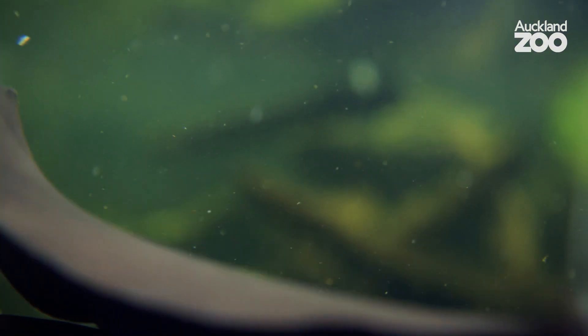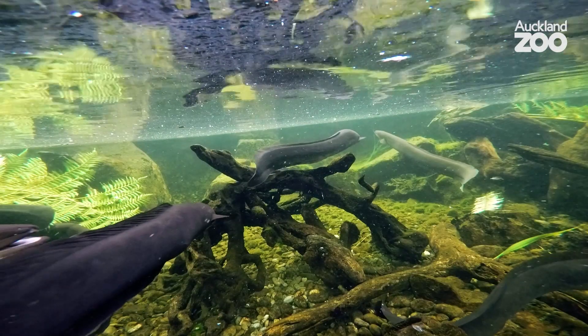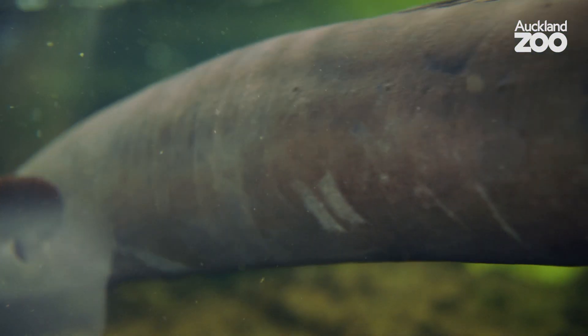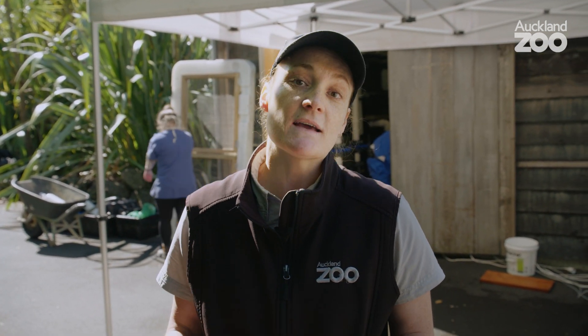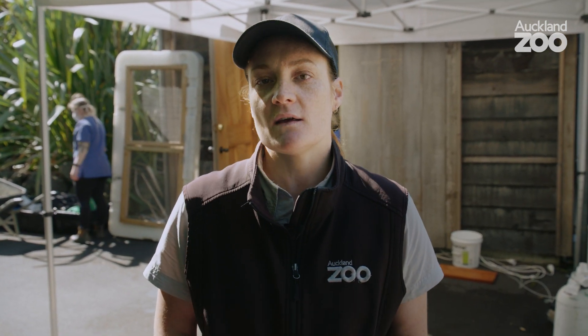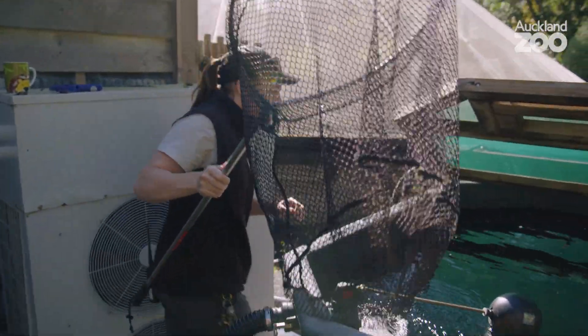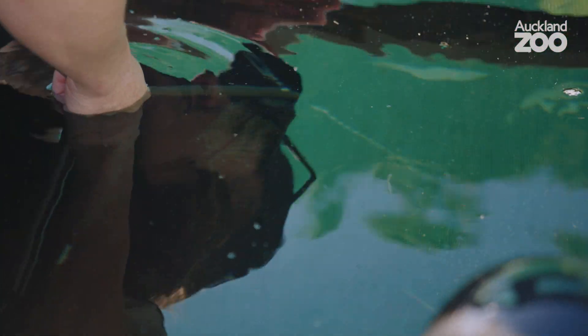The longfin eels here at the zoo arrived about nine years ago. We've got 11 currently in our big pool in the wetlands aviary. With the eel we x-rayed today, we noticed a slight bend in its back that looked like it was getting a little worse, so we pulled it off show and we're holding it in a special medical tank to monitor it. Having the vets come down to do these procedures means we can hopefully figure out how to make it better.